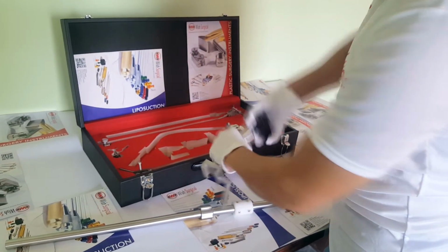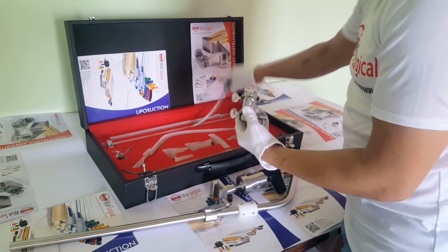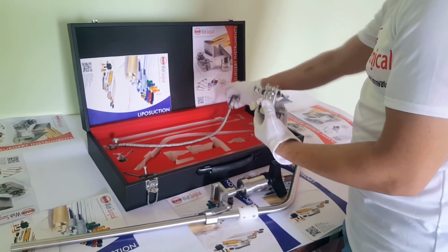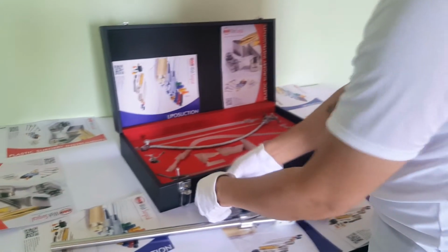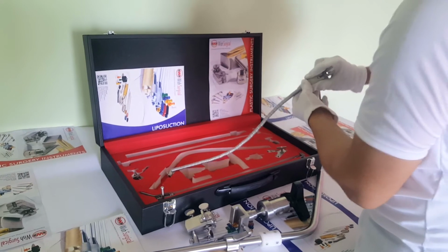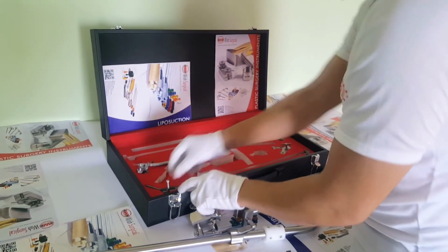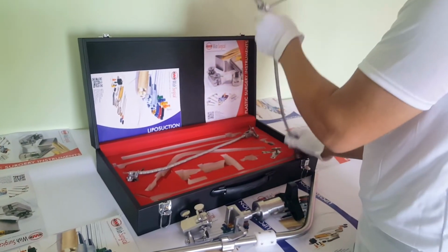Adjust with the back. Here, adjustable for the different two parts, like two arms. And you can tie it as per your requirement, with different angles. And here you can see these two arms.